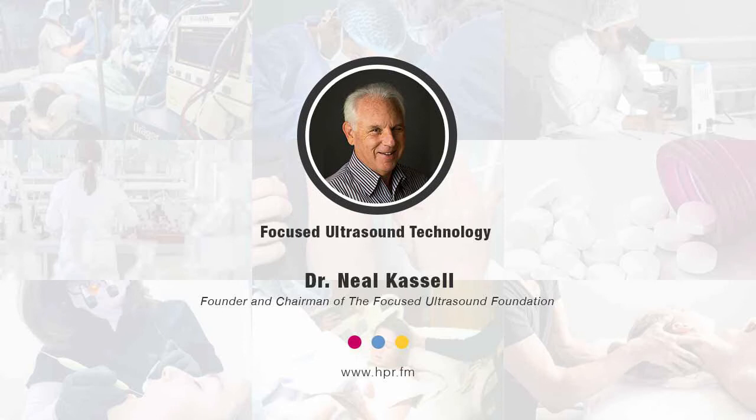So imagine using a magnifying glass to focus beams of light on a point and burn a hole in a leaf. Where all those beams converge, it heats up the point and burns a hole in the leaf. With focused ultrasound, instead of an optical lens focusing beams of light, an acoustic lens is used to focus multiple beams of ultrasound energy. Where each of the individual beams goes through the tissue, it has no effect. But at that focal point where all the beams converge, just like where the beams of light converge, focused ultrasound can create what we now understand are 25 ways that it affects tissue.